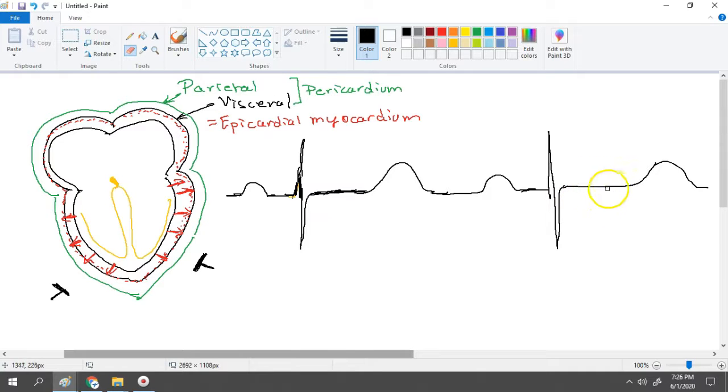This would have been for the middle part, and this is the part that is elevated for the epicardial part of myocardium. So, in short, since the current flows from the endocardial region to the epicardial region, if only the epicardial region is having an abnormal current flow or injury current, that will produce a deflection of only the last part, not the early, not the middle, because there is no injury current flowing in the endocardial region or in the rest of the intermediate part of the myocardium, but the injury current is limited.